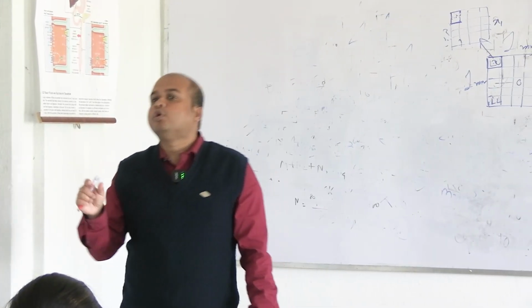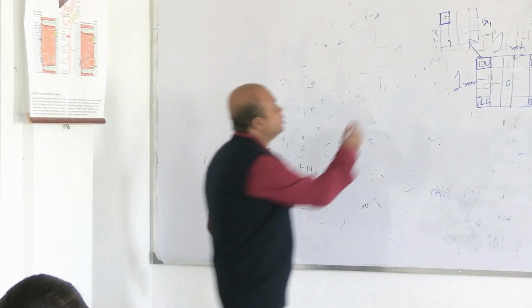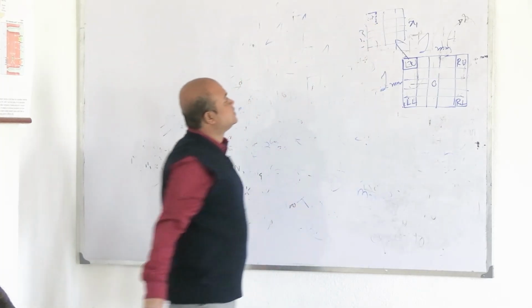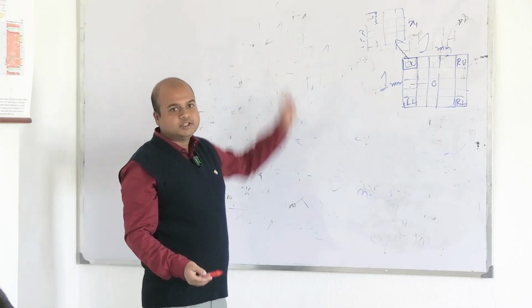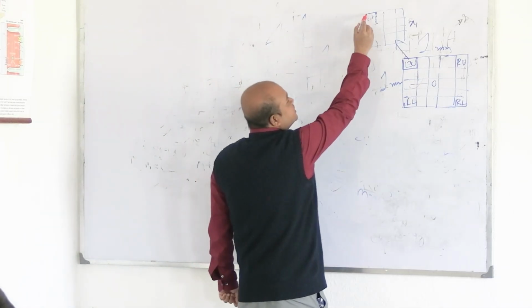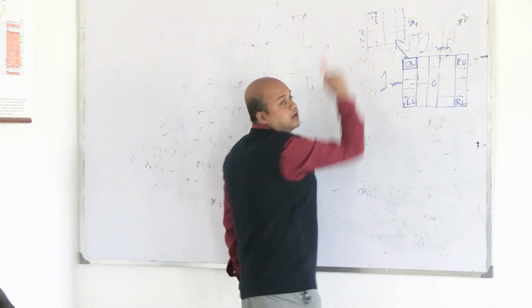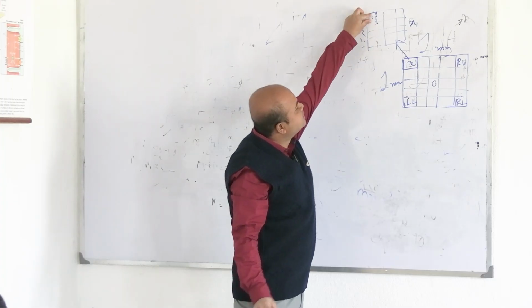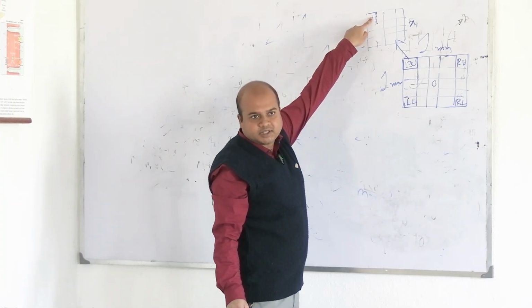So, when I count square number 1 of the small squares, the rule followed is these margins, which have, instead of red color, everything erased. So, think of this. This margin is counted and the inside is counted. So, rule of L, because I am writing it as an L. So, this is the cell count of this particular cell.